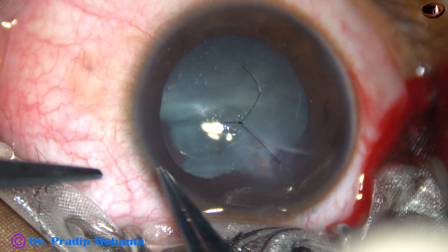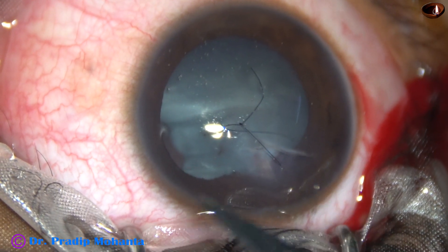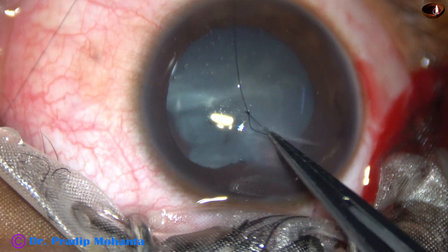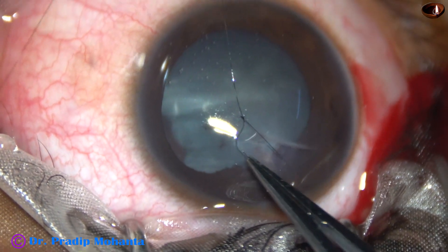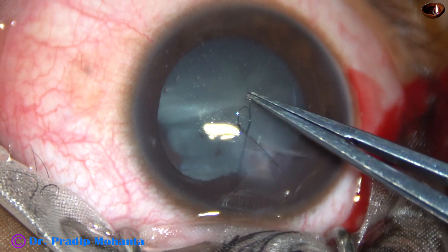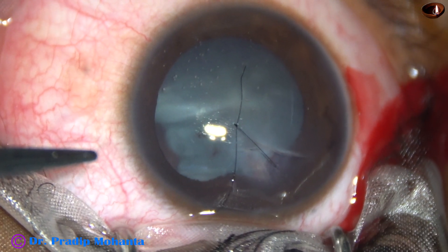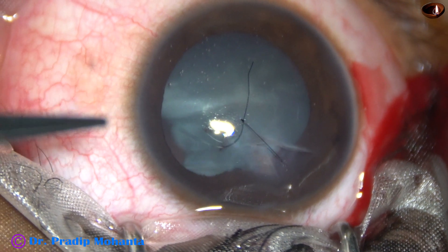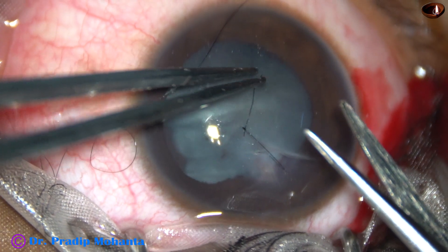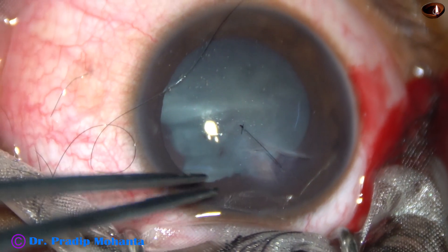Now this is the gap — the dehiscence at 2 o'clock. This is a 2-1-1 suture knot. The threads are trimmed close to the knot and the knot is buried.